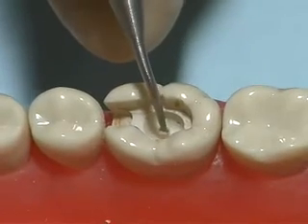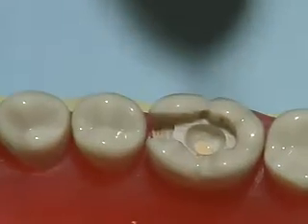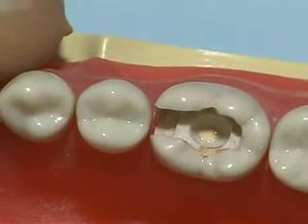Place it into the deepest portion of the cavity without contaminating the lateral wall. Allow the cement to flow along the floor of the cavity, then allow the cement to set.